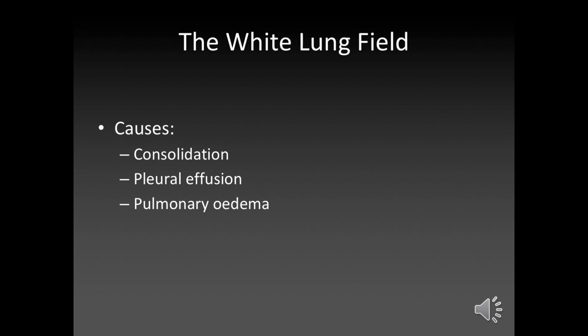And I used to get quite confused between pleural effusion and pulmonary edema, but if you just think about what they actually mean, it makes your life a lot easier. And fibrosis is the other one, so thickening and fibrosing of tissues. And collapse. So we've already seen one actually with a pneumonectomy, but collapse will look somewhat similar.